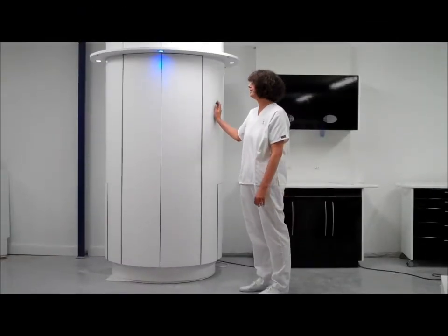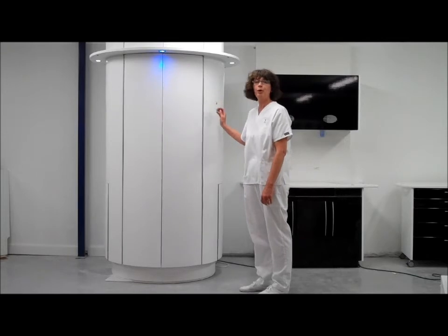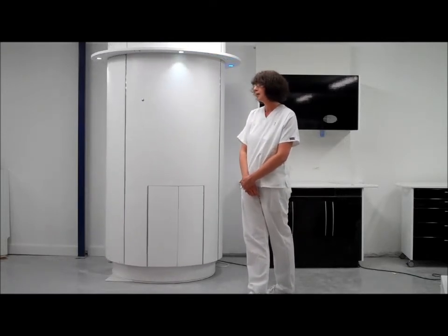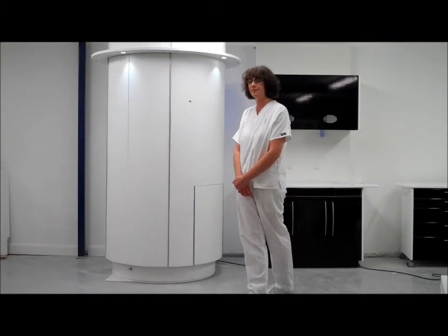Once the doors are closed, by pressing a button on the side, the pod rotates 180 degrees to its second resting position. This takes approximately 7 seconds.